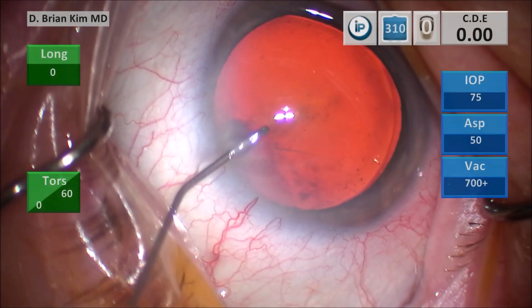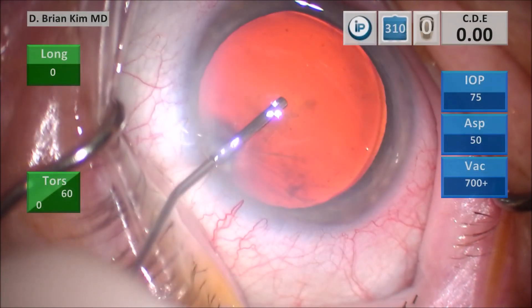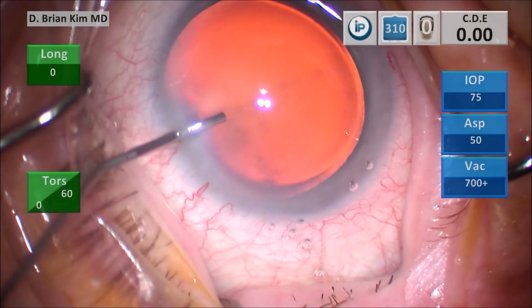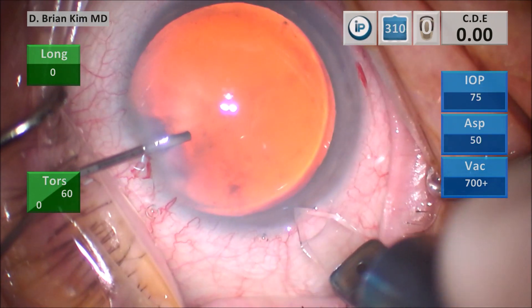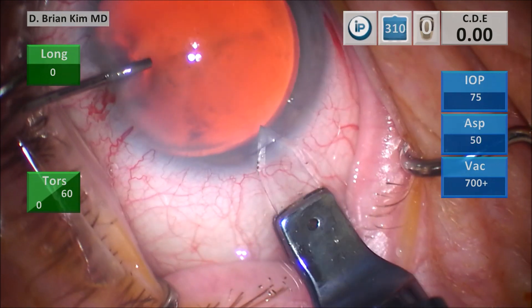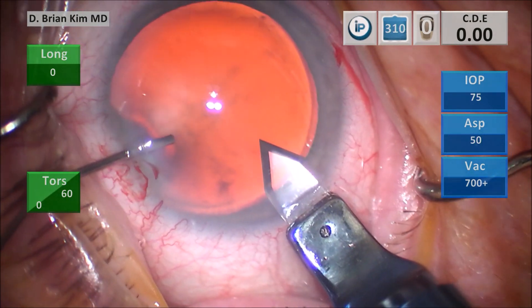I'm going to inject some lidocaine intracamerally and then some dispersive viscoelastic, using the cannula to hold the eye and then I'm going to use my diamond blade to make a triplanar corneal incision. I make a vertical groove, tunnel into the depth of the groove, tunnel through the cornea, dive down and then enter — and that's a triplanar incision.